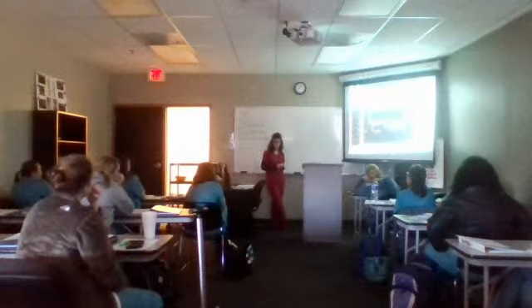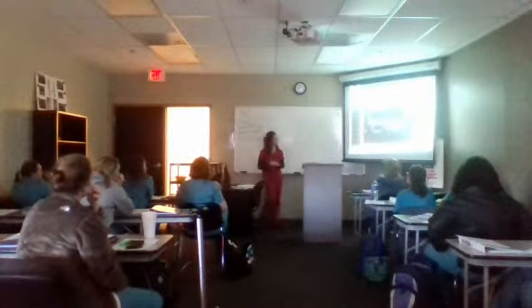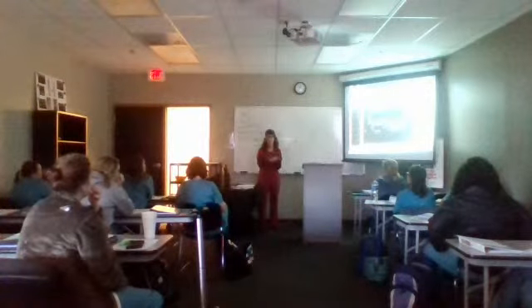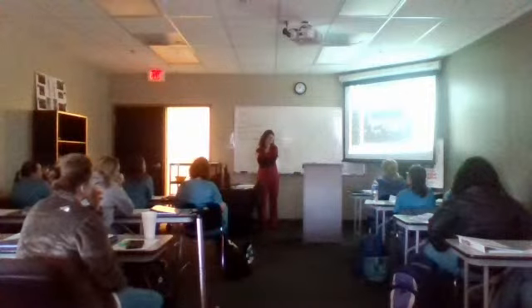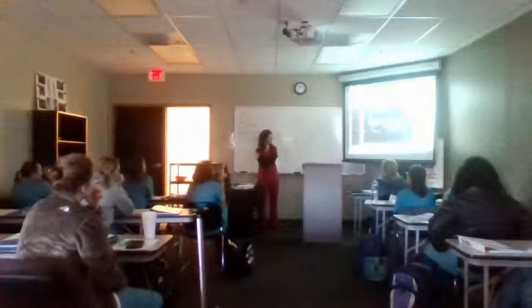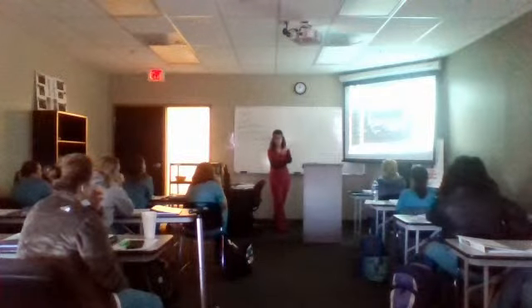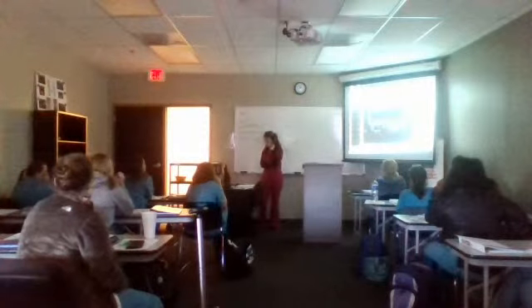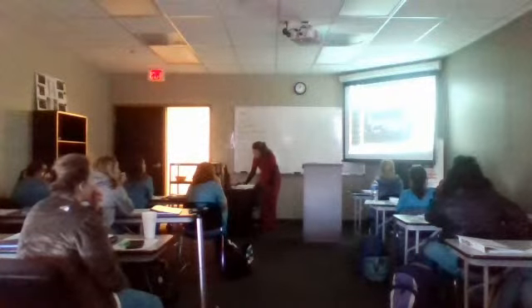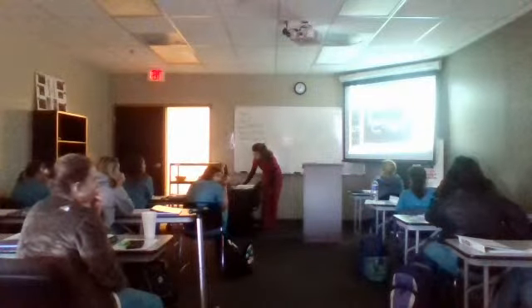I think it was Miss Bandu was telling me a story, I don't know if it was her or someone, they did a study, pushed down, the patient died right there on the table while they were scanning them. Threw it right to their heart and killed them. So, you have to be really careful before pushing down on a thrombus, all right? So it's very important to put color on before you do it. But that's just an example of what y'all will be doing. That doesn't terrify me at all.